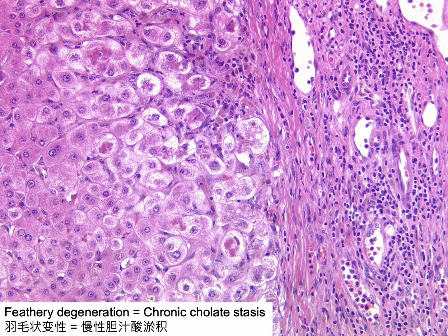Feathery degeneration is characterized by injured hepatocytes exhibiting cellular swelling and rarefaction of the cytoplasm, with several Mallory-Denk bodies also observed. This type of degeneration arises from the detergent effect of retained bile salts, known as chronic cholestasis in cholestatic conditions. Morphologically, feathery degeneration closely resembles ballooning degeneration on light microscopy, especially when containing Mallory-Denk bodies, and both types fail to express cytoplasmic CK8/18.